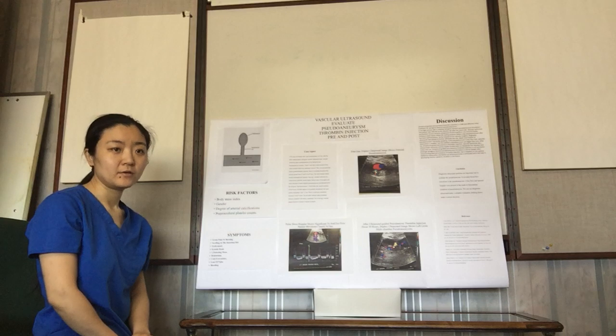The fifth is, do you know what is the safe and effective initial treatment for pseudoaneurysm?